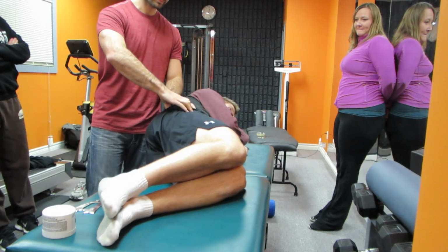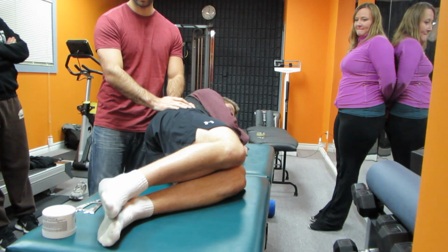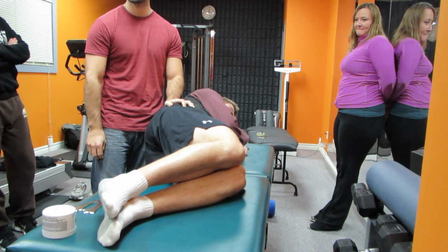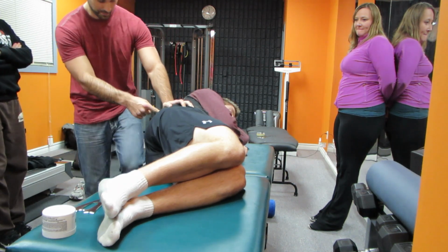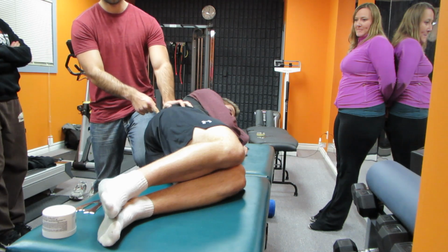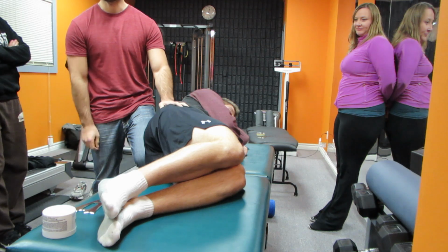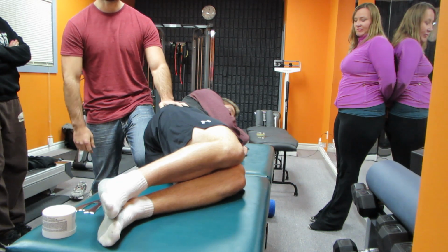First, if we're going to treat your piriformis type stuff, we want to treat the tissues around it first. Obviously, if we have him face down and want to get into piriformis, the butt is way too big. You're not going to be able to get through it, and you're just going to end up wasting a lot of time, and nothing's going to happen.